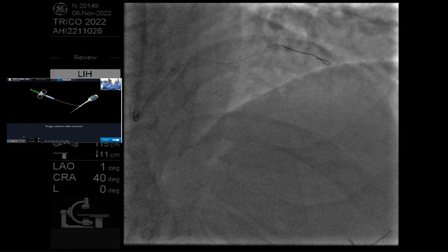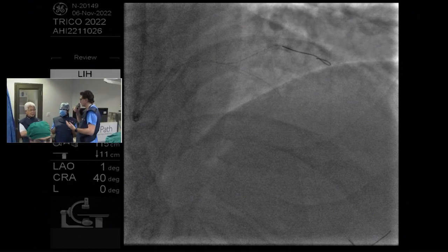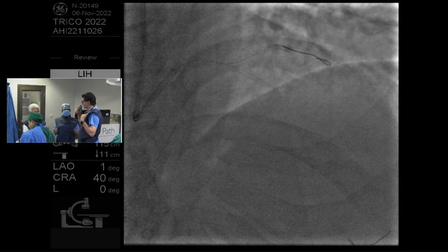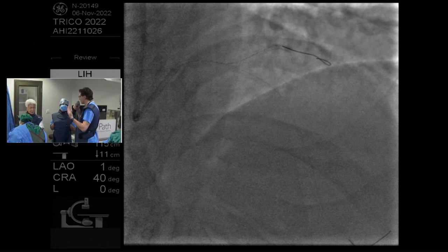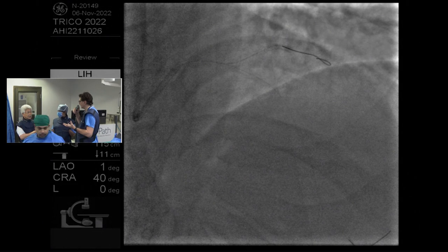I agree with you. However, I would like to ask Dr. Akasaka, Professor Akasaka here: in my opinion, when you have decided to put the stent, it's okay if you do the imaging after, where you think that the imaging catheter, whatever you're using, will not cross. However, the beauty of imaging is to do every step of it up front. So if I think that it will cross, I would prefer to do it at the beginning, before we start modifying the lesion. What is your pick on that?